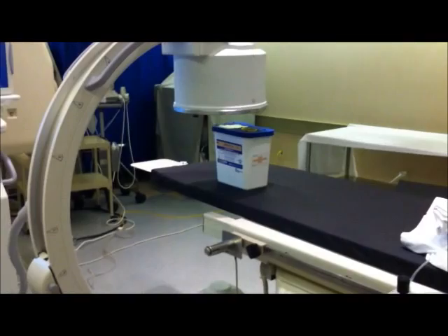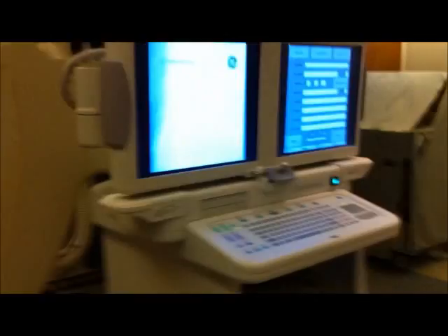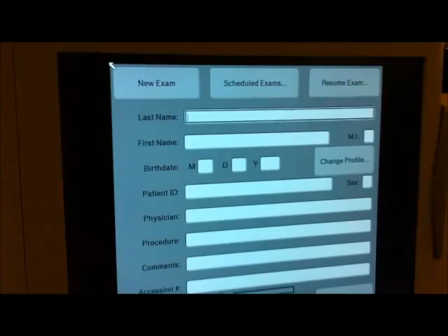It looks like we got our patient there — a box of used drugs. So the first thing you do when you come into the room before you use a C-Arm is you want to input the patient information.